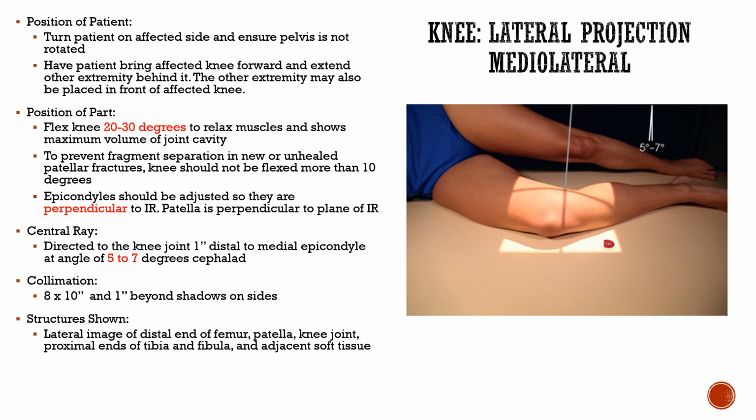We want to prevent fragment separation in new or unhealed patellar fractures, so the knee should not be flexed more than 10 degrees. The epicondyles should be adjusted so that they are perpendicular to the IR, and the patella is perpendicular to the plane of the image receptor.